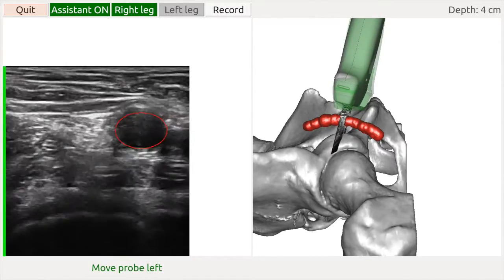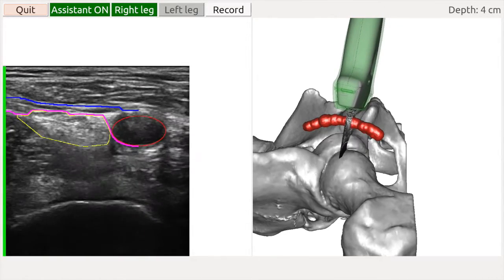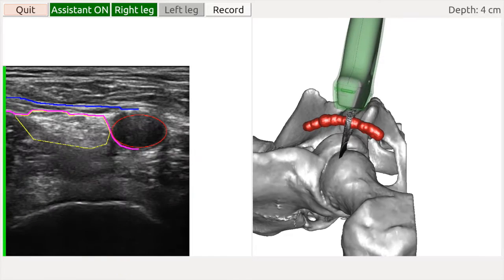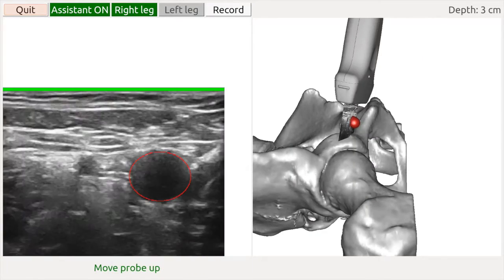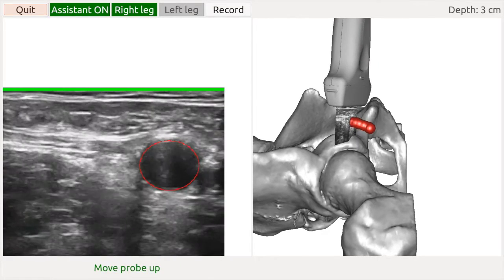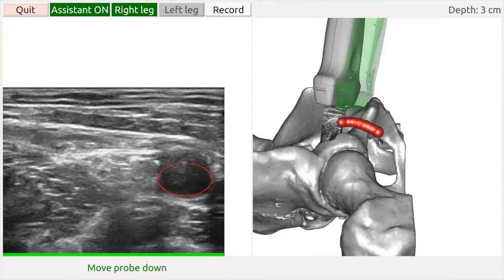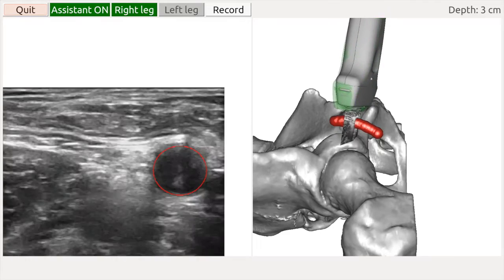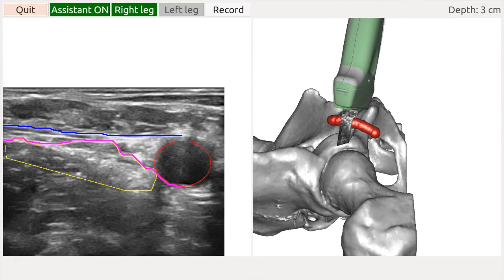When the assistant functionality became available, the pre-recorded data was run through the assistant software, and the result we can see here: the probe positioning of the expert matches quite well with the green ghost probe of the assistant. We will now show an example where a novice user was asked to use the tools provided by the assistant in order to arrive at the right probe location. The user is first asked to locate the artery, then to move the probe upwards, and we can see that the green ghost probe appears. The user is asked to align the probe with the green one, and we can see that the match is quite good.